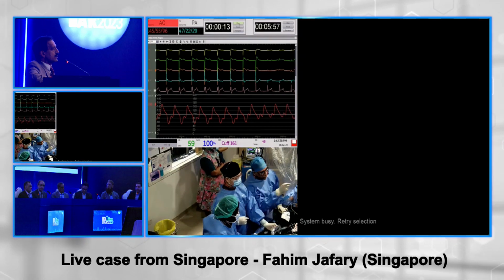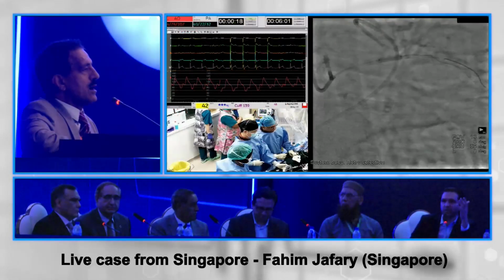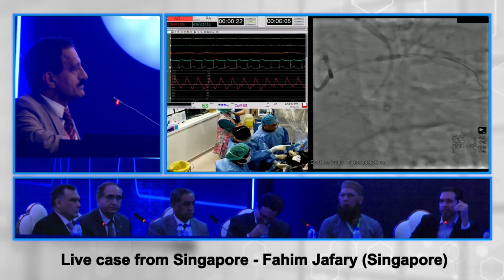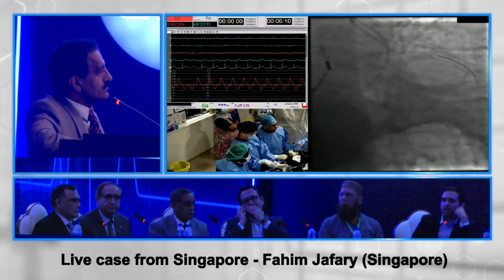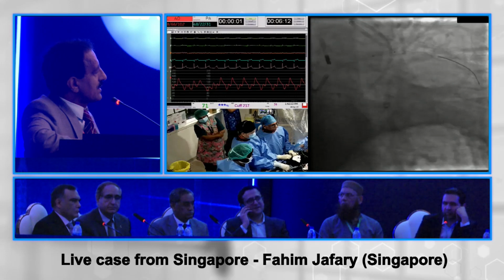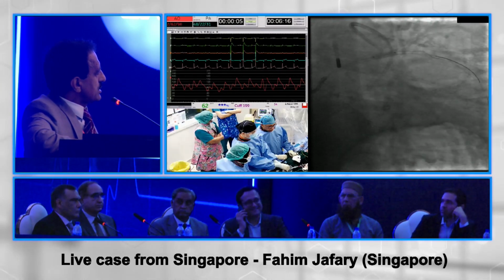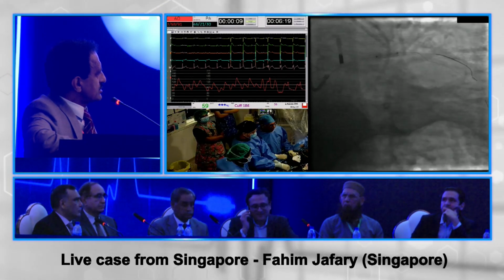In terms of plaque modification, any preferences in terms of the cutting balloons, your Wolverine or AngioSculpt or the Chocolate balloon? Some people like any preferences in terms of profile, or which one they would prefer? Ashok, any particular preference for any cutting balloon like AngioSculpt, Wolverine or Chocolate balloon, or have you used all, or do you just stick to one?